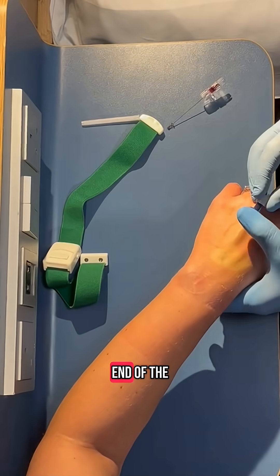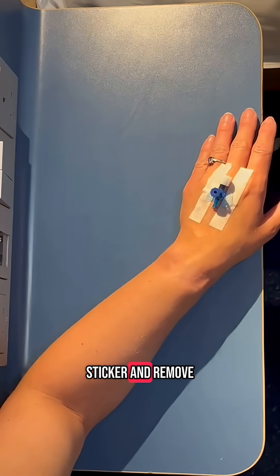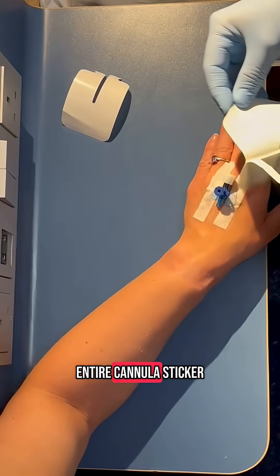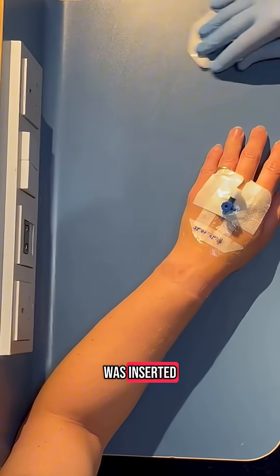Place your plastic cap on the end of the cannula to secure it and to stop blood from flowing outwards. Take your cannulation sticker and remove the two long strips. Next, remove the entire cannula sticker backing and place over the device. You can then apply a date sticker so everyone knows when the cannula was inserted.